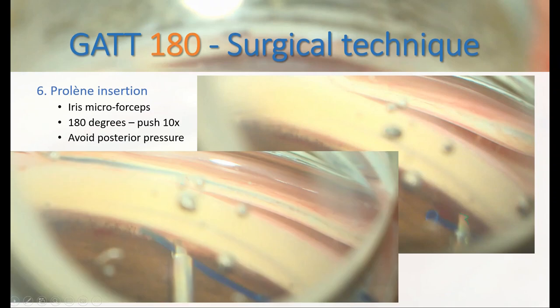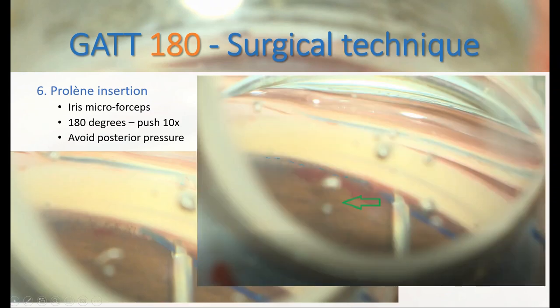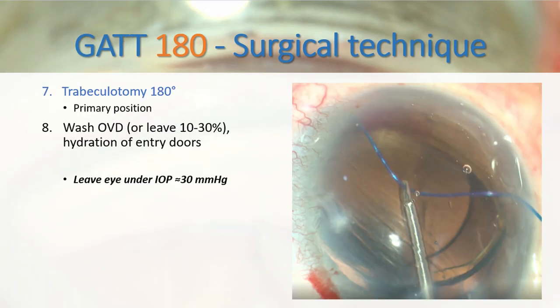Using an iris micro forceps, we insert the 5.0 Prolene through the goniotomy and into Schlemm's Canal. We pull the suture centripetally so that we rip off the internal part of Schlemm's Canal, performing a trabeculotomy.